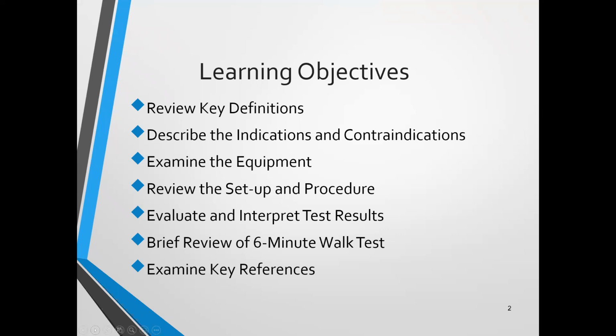getting an increasingly heavy load of exercise stress placed on them, they need to be monitored very closely, for how they're tolerating it and for the outcome measures, but also to ensure that they're not getting overstressed and starting to do things like, their sensorium is affected, their oxygen saturation is dropping, their heart rate is going too high, and or they're experiencing a dysrhythmia. So they're monitored beforehand, and afterwards they're monitored, but there's also a lot of computerized tabulation and interpretation as well.